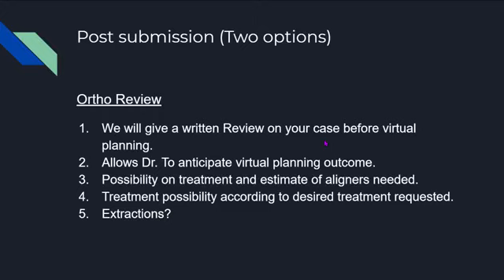So for example, when a doctor sends us a case, we can do an ortho review without the impressions or the stone models. With your x-ray, patient photos, and the RX form, this is what we can use to do our orthodontic review. So it's quite important for you to let us know if you want to do an ortho review first, or if you want to go straight to the virtual treatment planning.